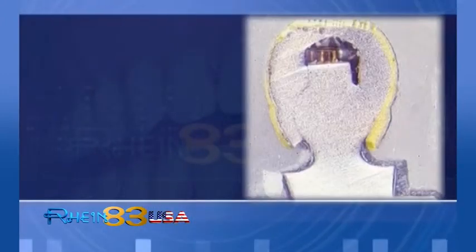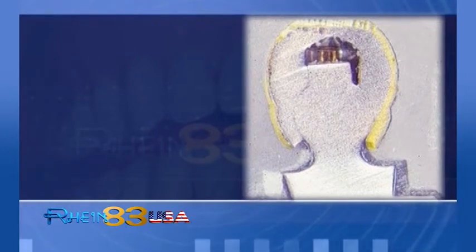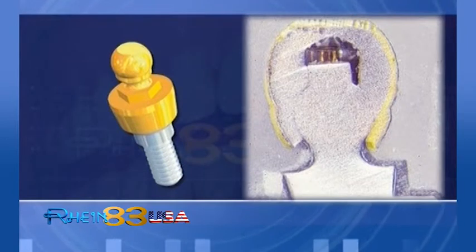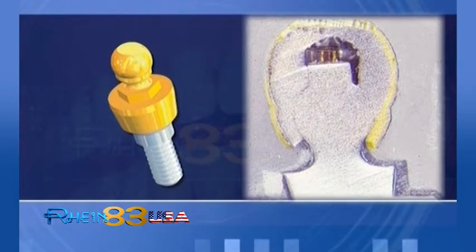Step-by-step procedures both for clinical and laboratory are illustrated in the catalogue. Carefully follow video instructions. SpheroFlex Grade 5 ELI titanium. Precision mechanical connection reduces or eliminates traumas from denture insertion procedures.